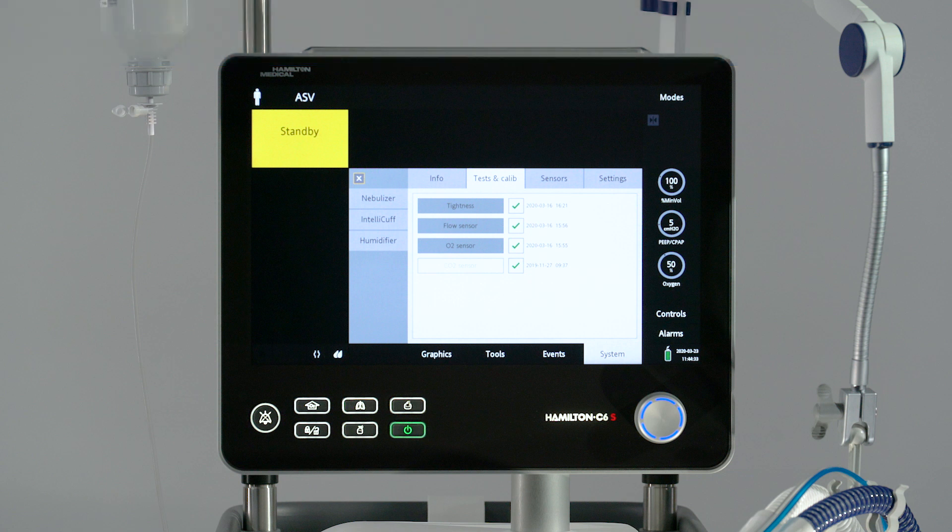A green check mark indicates the component is calibrated and ready, while a red X indicates the last calibration was unsuccessful. A box with no marks indicates the test or calibration has not been performed. If the CO2 sensor is not enabled, the box will be grayed out. Perform a tightness test and flow sensor calibration each time you have connected a new breathing circuit or component, including a flow sensor.